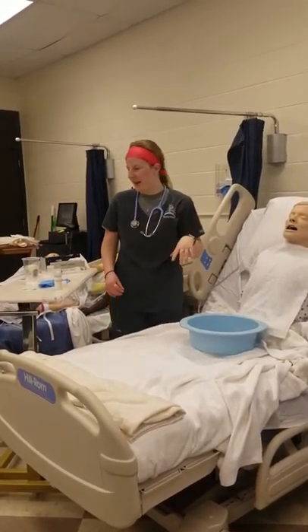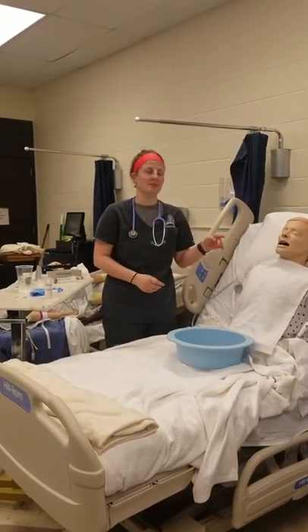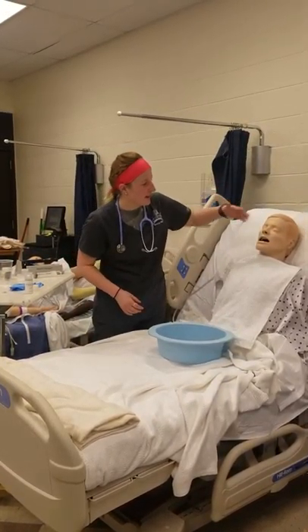I would have my pen light and I would check both nares to see which nostril is more patent, so I could go down with easier access. I'm going to go ahead and pick his right side here.